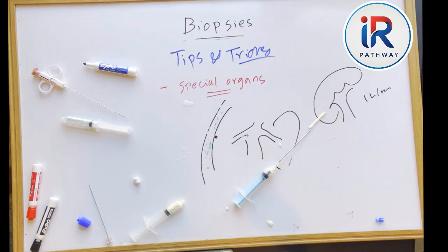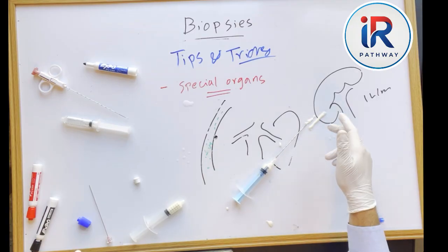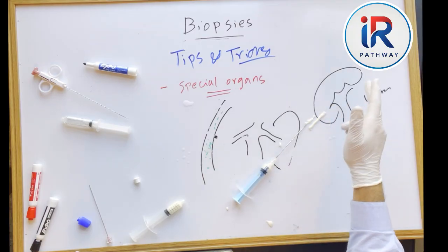So, what's the advantage? As mentioned, it immediately stops bleeding and it's temporary, as it's completely absorbed after 4 to 6 weeks. My advice is that if it is available in your place, don't overdo it. Just use enough to line the tract and stop bleeding. Don't overdo it because if it enters the bloodstream, it may cause serious complications.